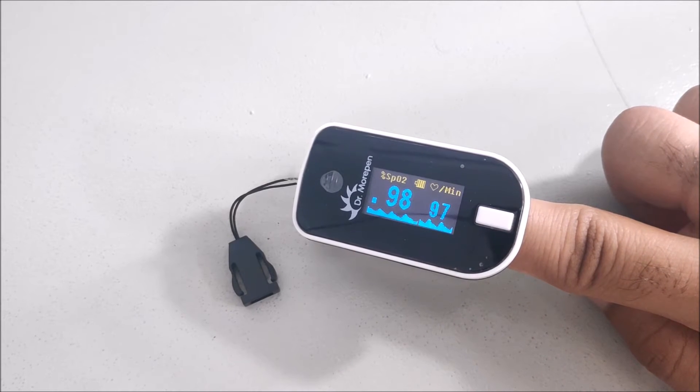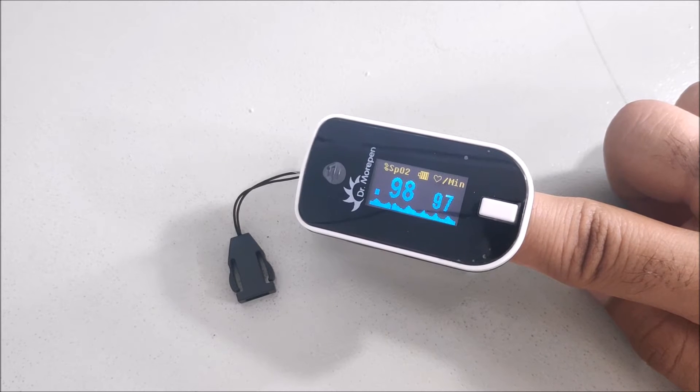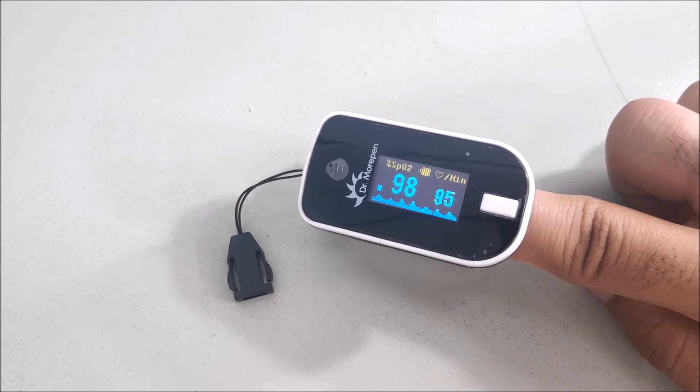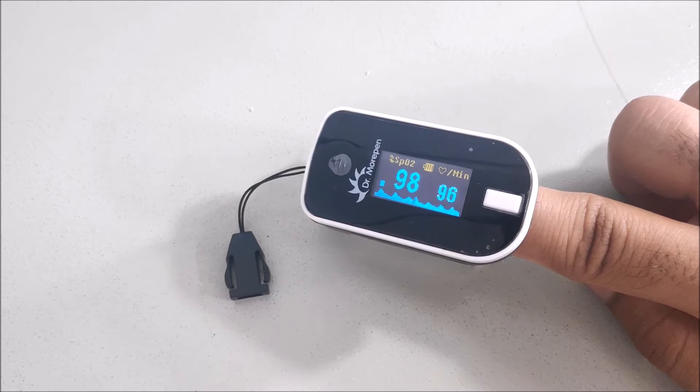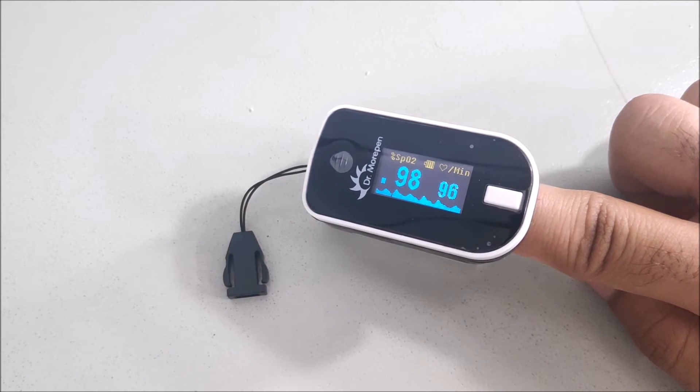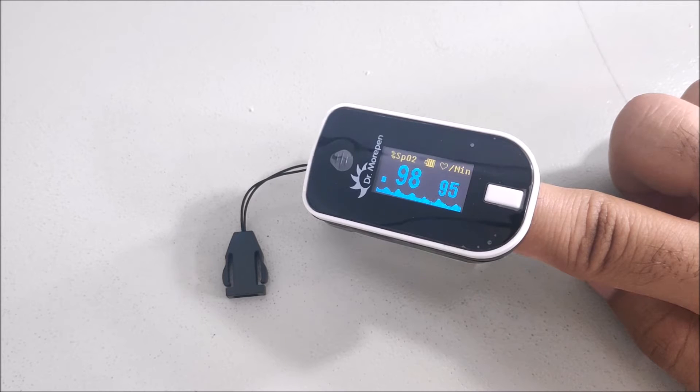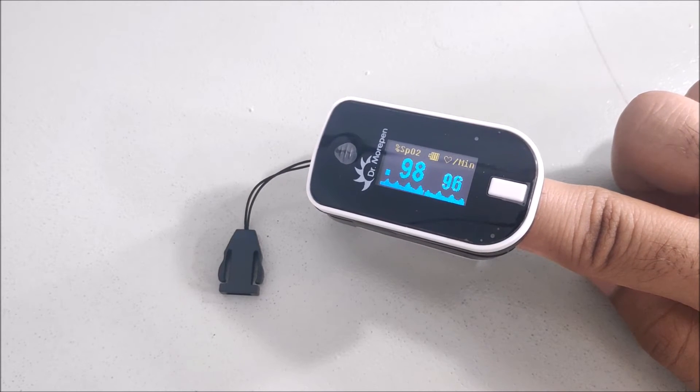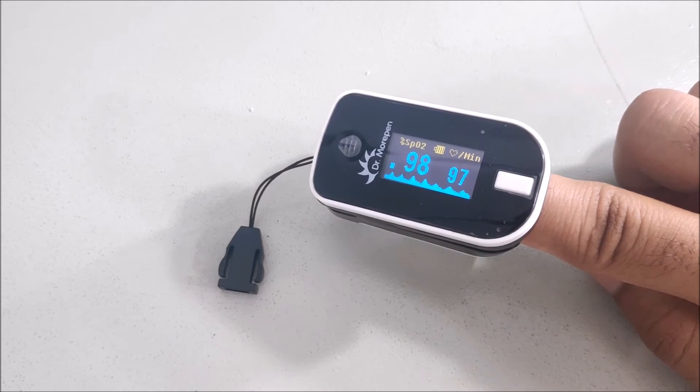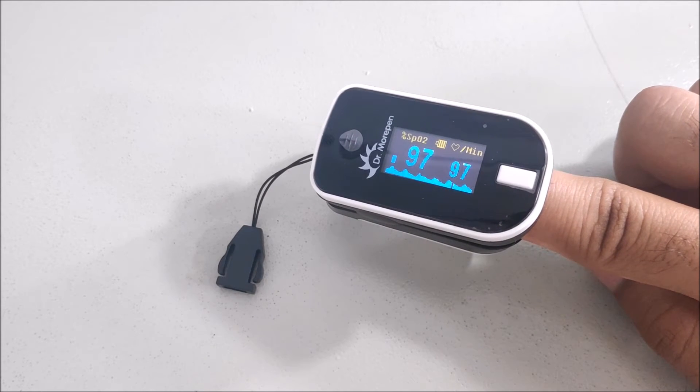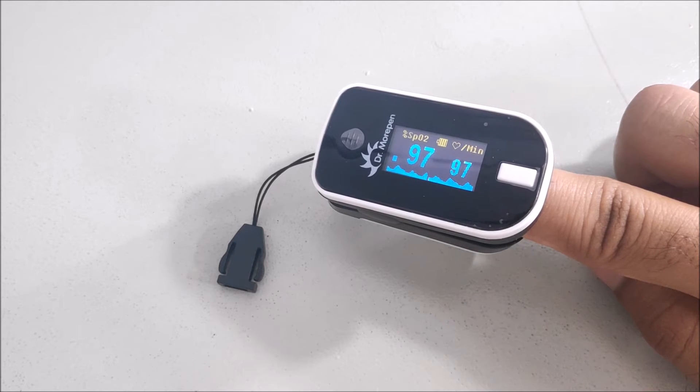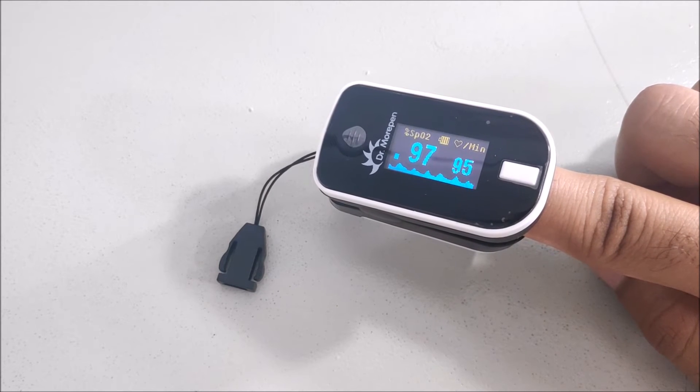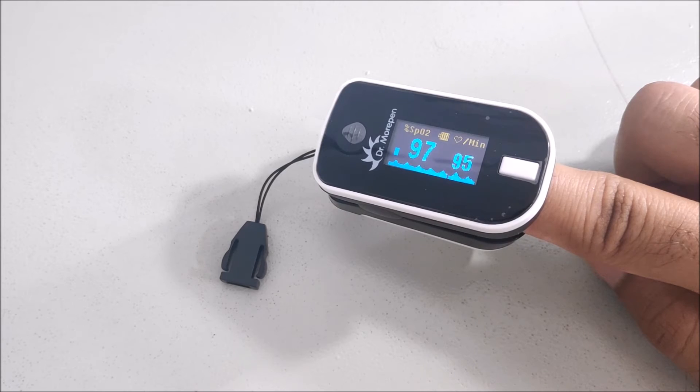There are two readings. First is the SpO2, which is the oxygen saturation in blood, and second is the heartbeat. It currently shows 98% oxygen saturation, which can ideally be maximum 100%, but most of the times it's 98 to 99% or 97%. The second reading is showing the heartbeat.